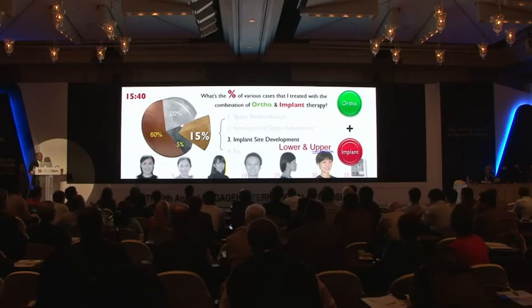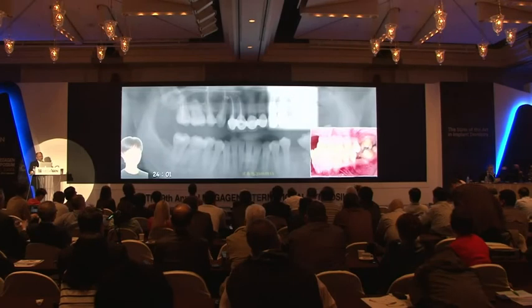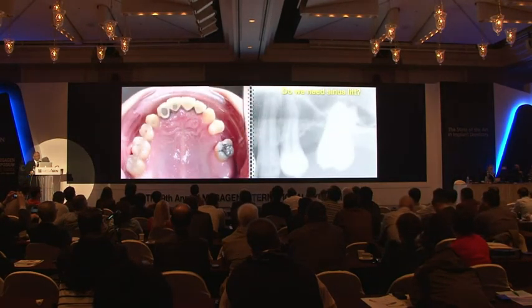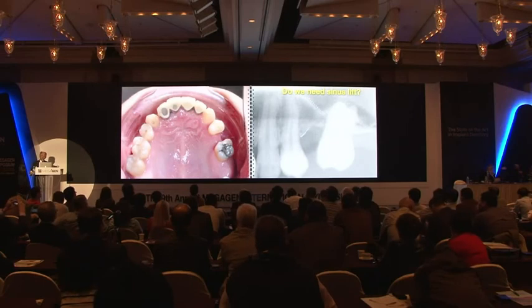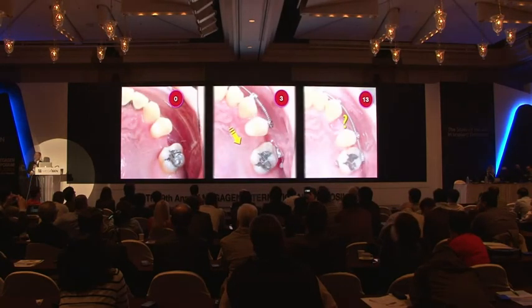So, once we know the law, what will be the upper? Suppose you have a case like this. Do you need to do sinus lift? Because it's just 2 or 3 millimeters. And the patient did not want to have sinus lift.